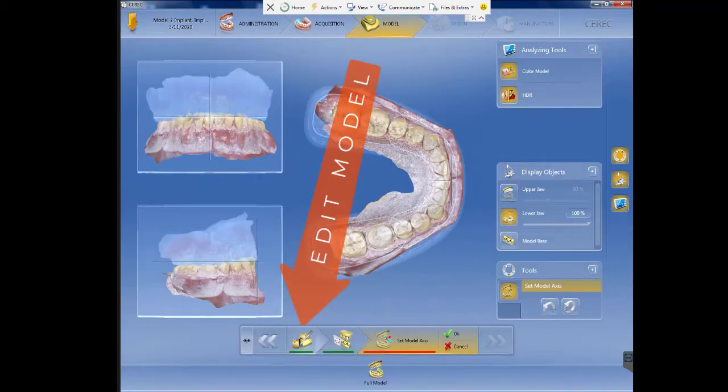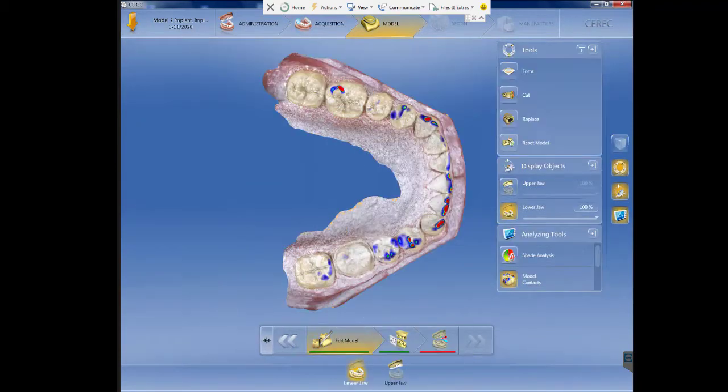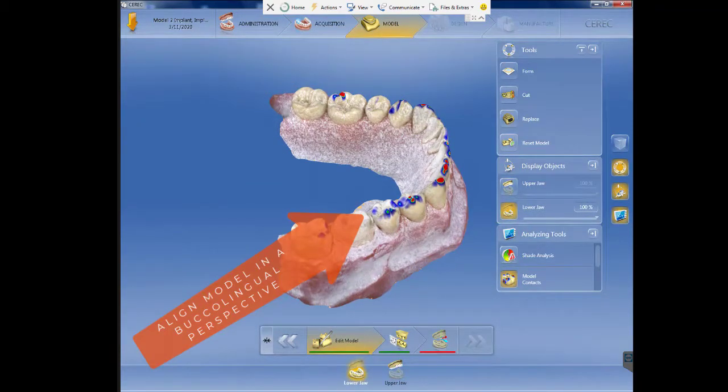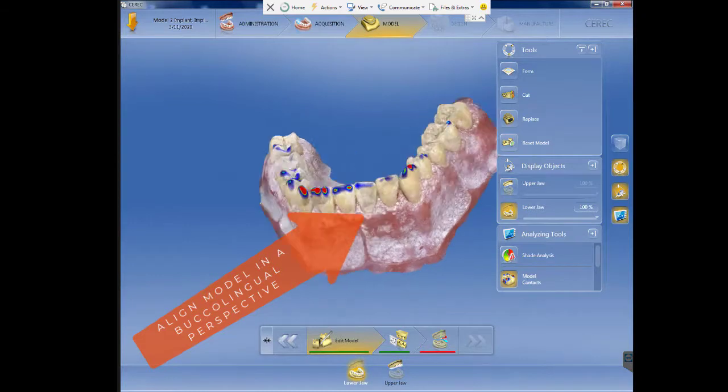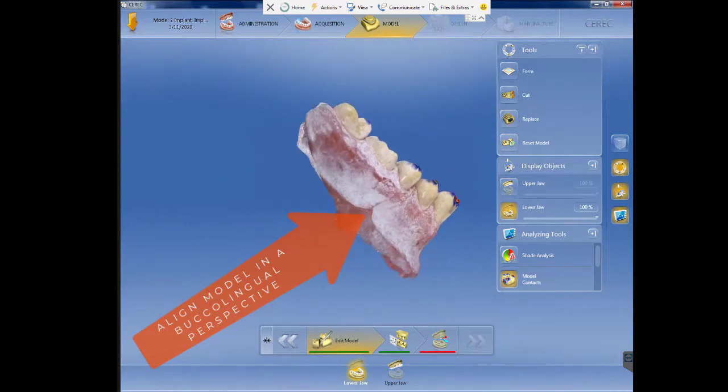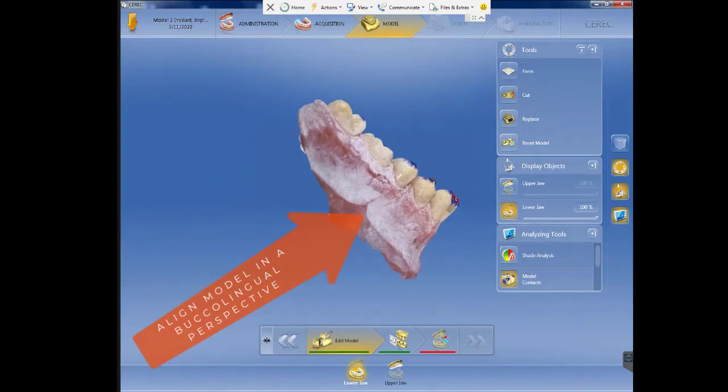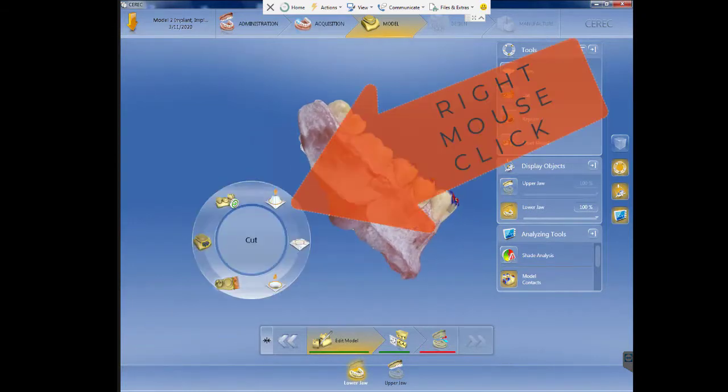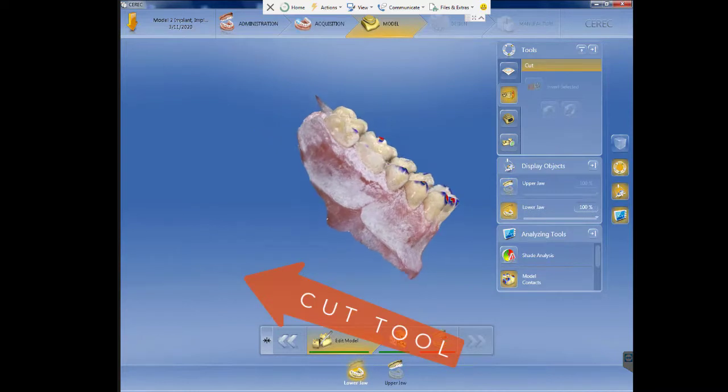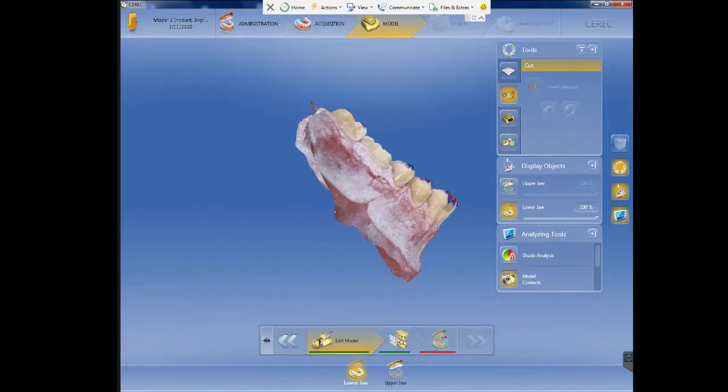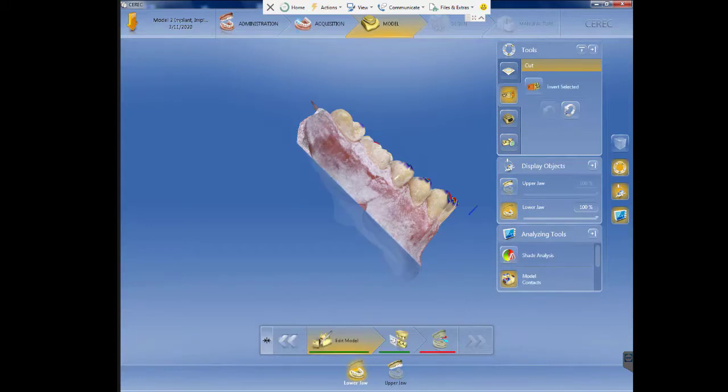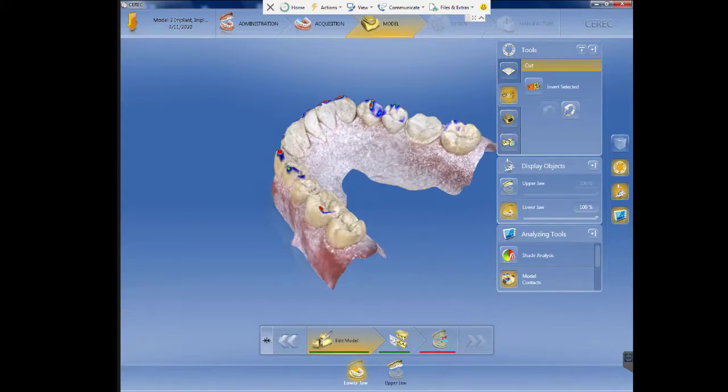Then you click OK, go to edit model, and then you will align the model in a buccal-lingual position so you can cut and have a base. You will use the right-click and then the cut tool, double-click and select this as your base. This will prepare the model so we can print it.